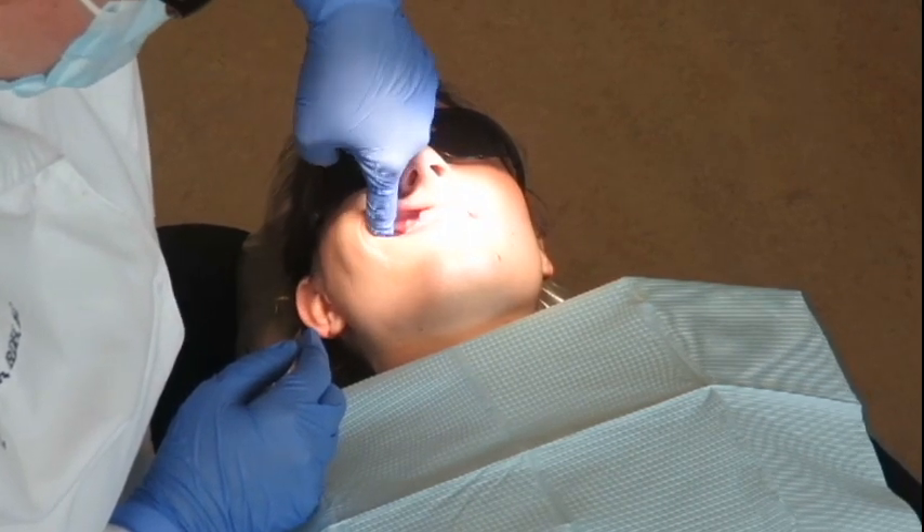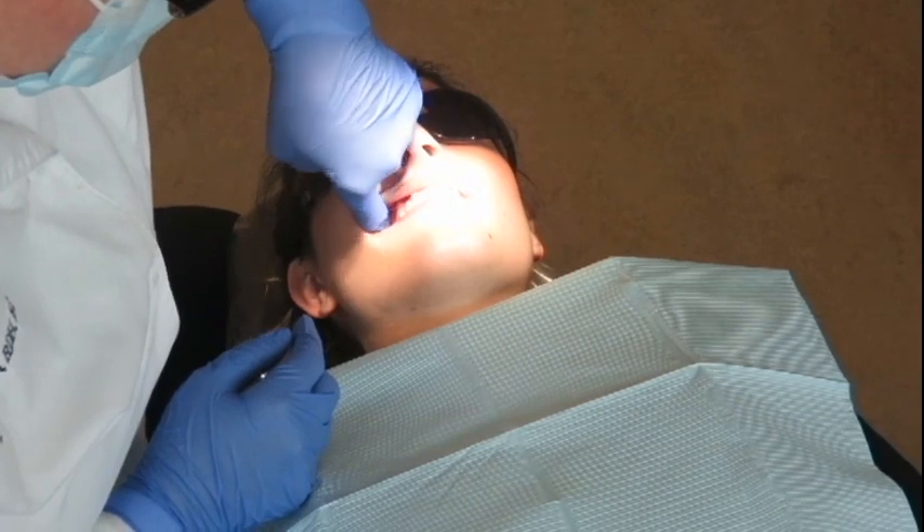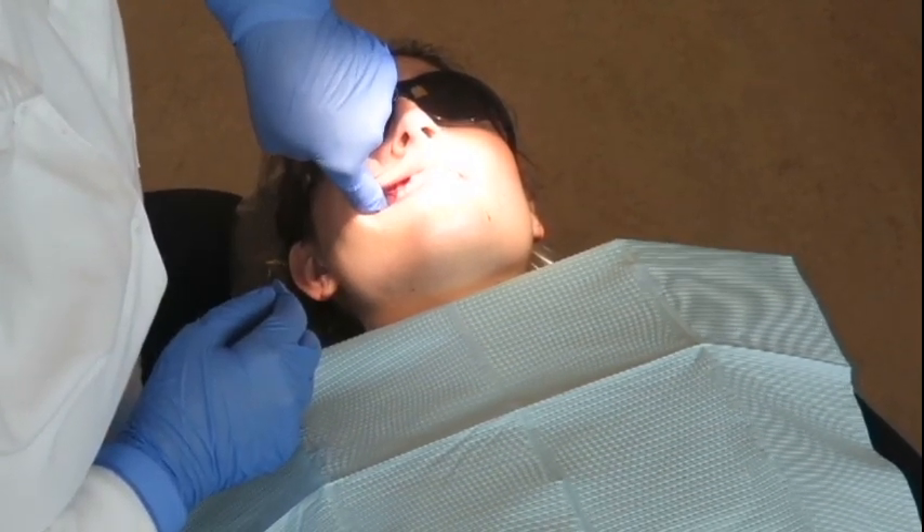That's the bone right there. And then you're going to keep going until your finger falls into the soft spot behind it. Your site is going to be in the middle of that soft spot.